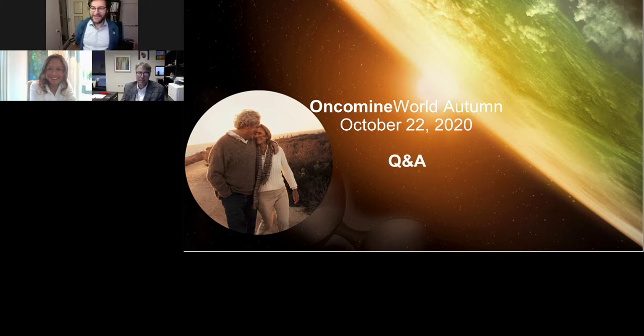Craig, I don't know if you had any experience in that. Yeah, I think that usually, with most straightforward cases, there's a high level of agreement between send-out and what we do in-house. Where you can run into some differences would be variants that are difficult to detect, like if the depth is much higher on one assay or another. But another thing is variants can sometimes be annotated differently on different pipelines from different labs, and that can cause confusion. It's the same variant, it's just described differently. I've noticed that occasionally happens.